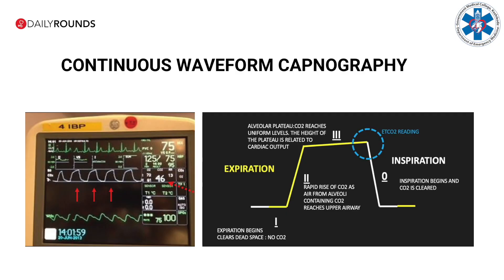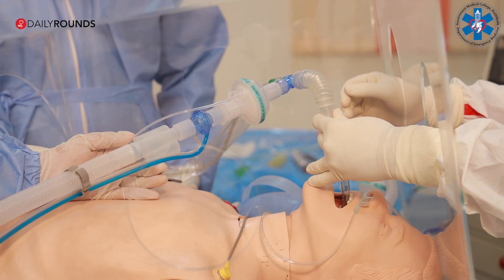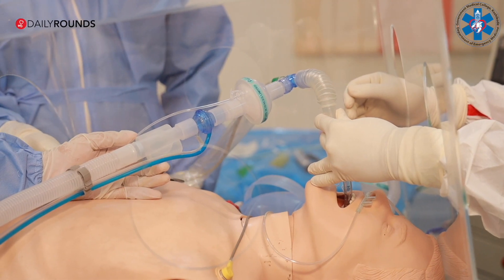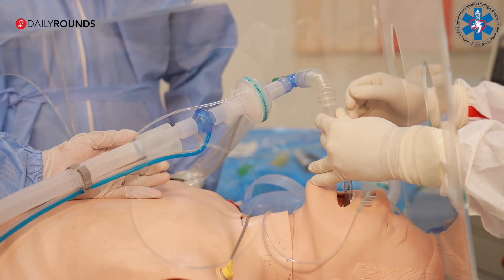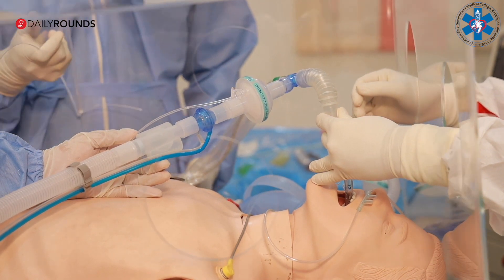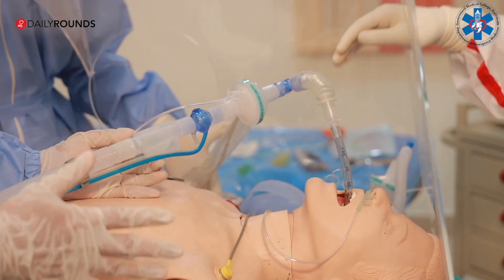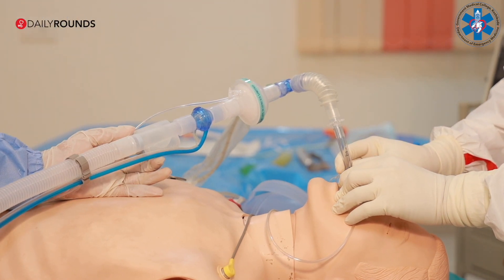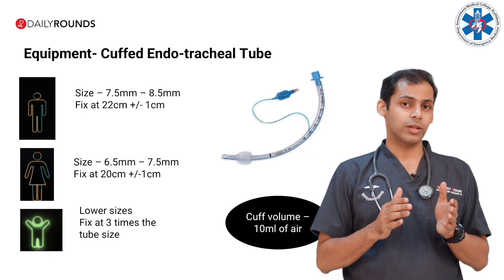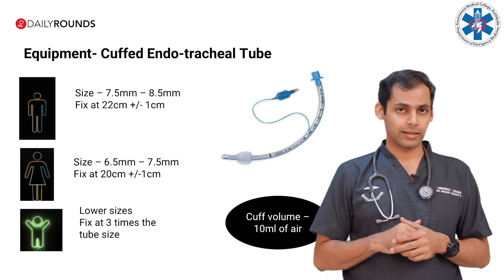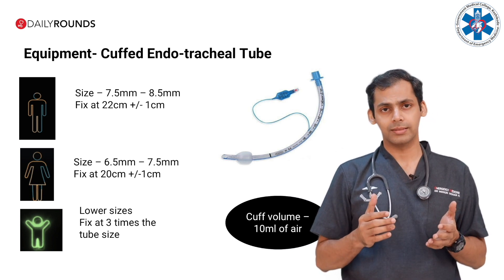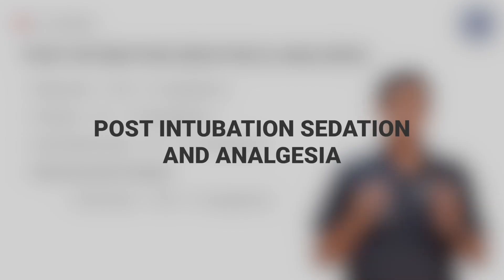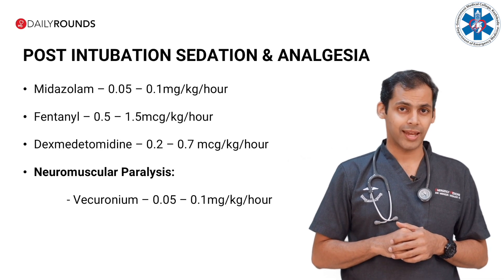Continuous waveform capnography is recommended to confirm tracheal tube position. Bedside ultrasound may also be used. Exclude bronchial intubation by 5-point auscultation or chest X-ray. Carefully remove the aerosol box after this. The ET tube should be fixed at about 20–21 cm in females and about 23 cm in males.